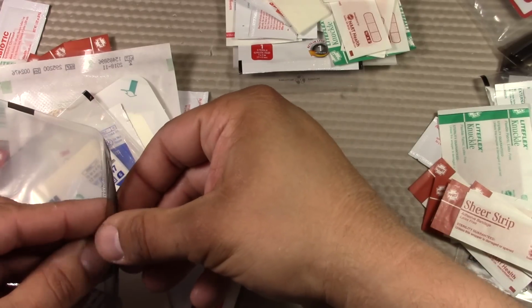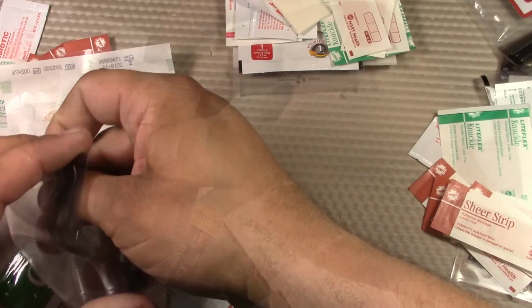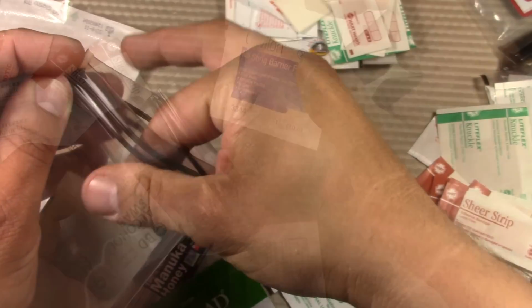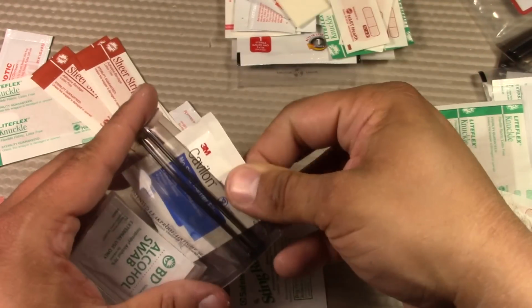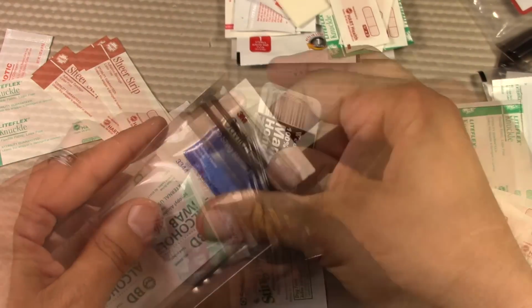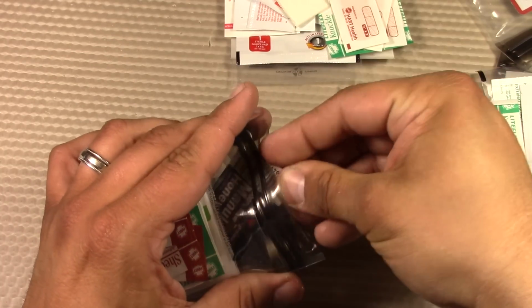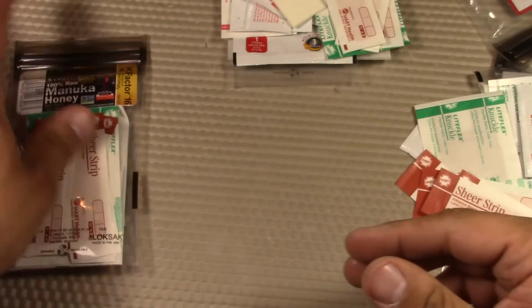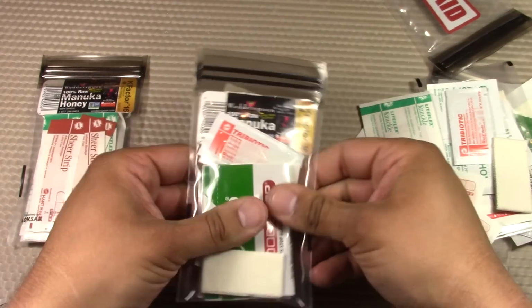Let's start putting them together. One down, 2 more to go. Just 2.